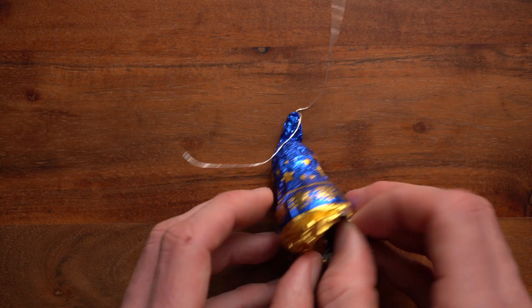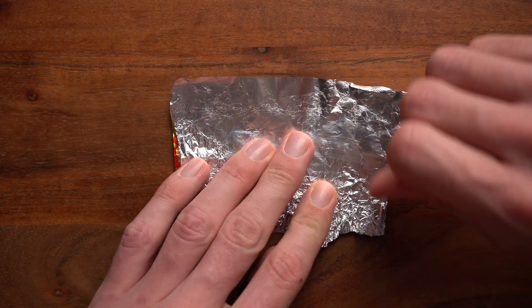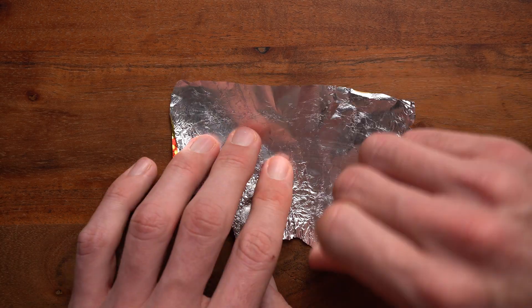Step one: open your chocolate carefully and eat it. Step two: use your fingernails to iron out all the wrinkles. Really take care that your tinfoil is nice and flat.